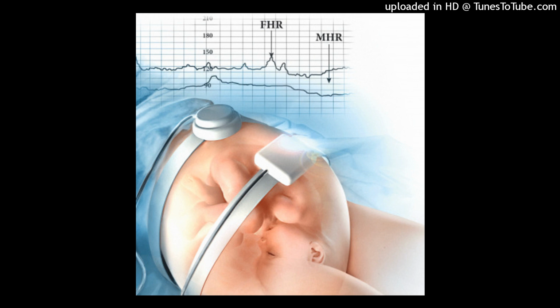Prolonged decelerations. Similar to variable decelerations, prolonged decelerations are either periodic or episodic and are generally isolated on the tracing. These decelerations are defined as a decrease in the FHR that lasts a minimum of 2 minutes and no longer than 10 minutes from onset to return to baseline. Figure 14.5. After 10 minutes, the deceleration is considered a baseline change.